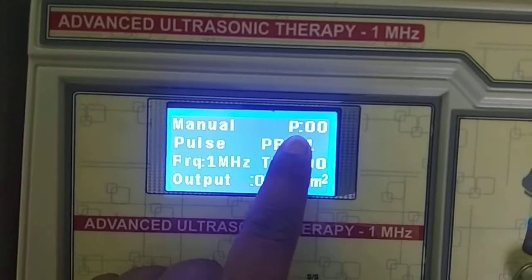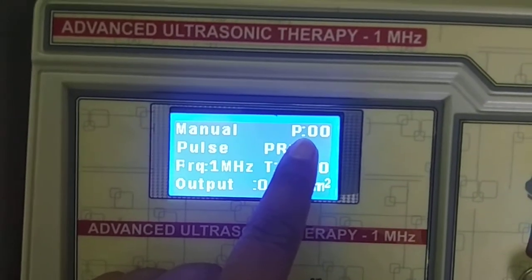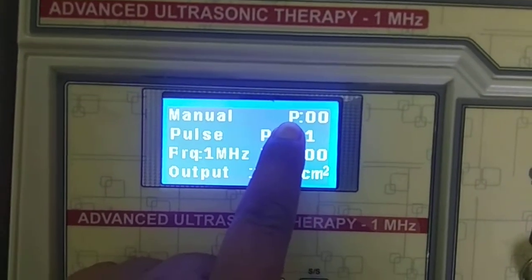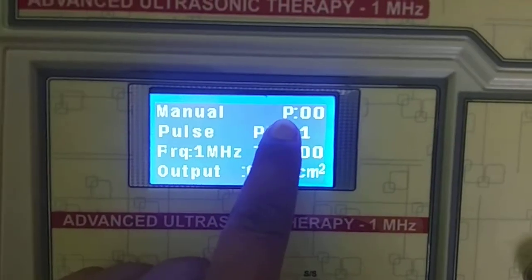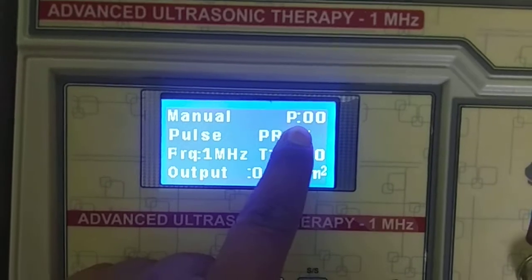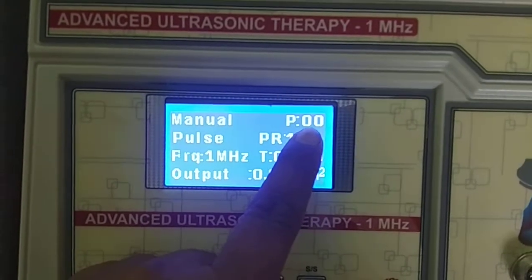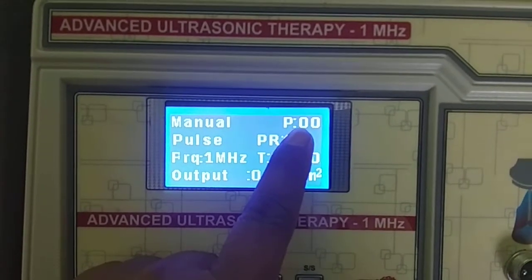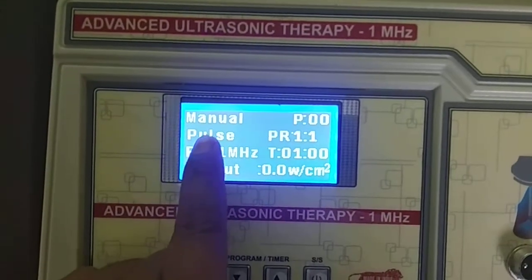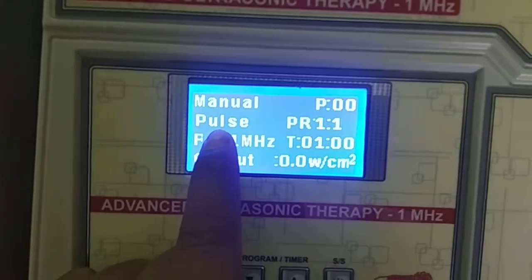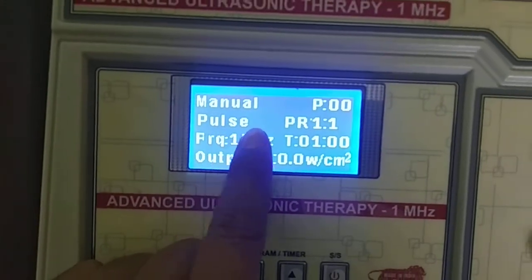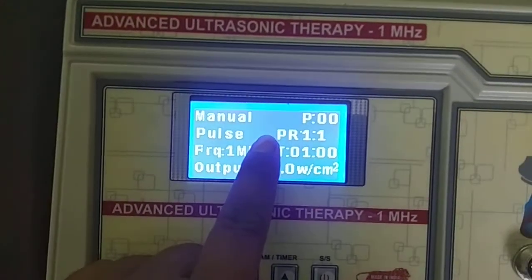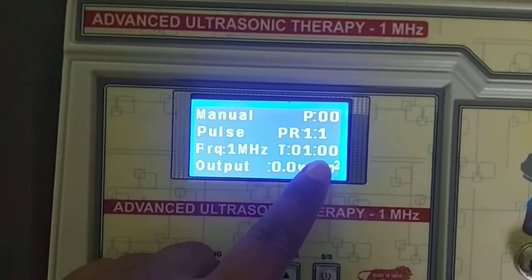Two modes are given in this device. The first is Program mode, where 55 programs are fixed, and the second is Manual mode, where Pulse and Continuous modes are available.